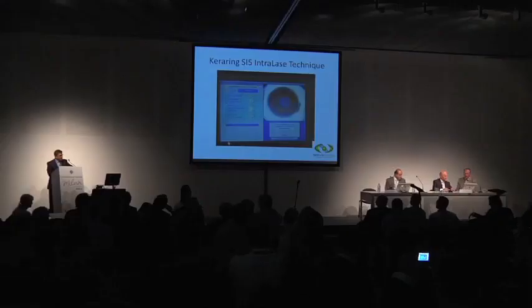So in this small study, we used sequential Keraring implantation and Cachet for keratoconus treatment. As inclusion criteria, we used eyes with keratoconus that had sequential intracorneal ring segment implantation and anterior chamber phakic intraocular implantation using the Cachet IOL. All were keratoconus, contact lens intolerant, with clear cornea. Maximum keratometry was 55, minimum keratometry more than 40 diopters, and minimum corneal thickness more than 400.